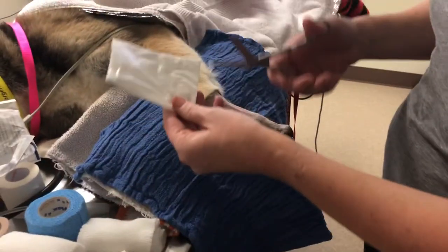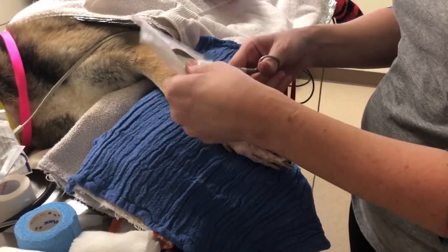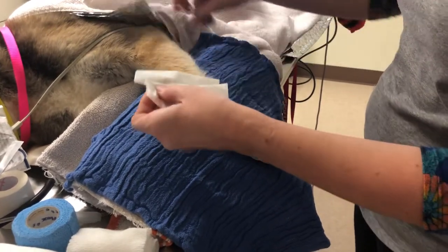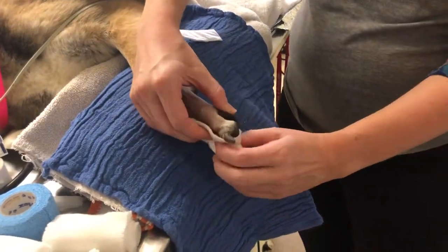I'm going to take a telfa and cut a small piece for the other side as well. I'll lay one telfa here — it's going to wrap around nicely, so I'm just going to wrap it like this.